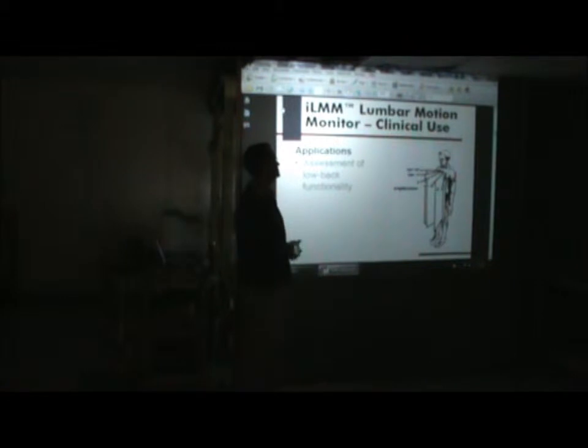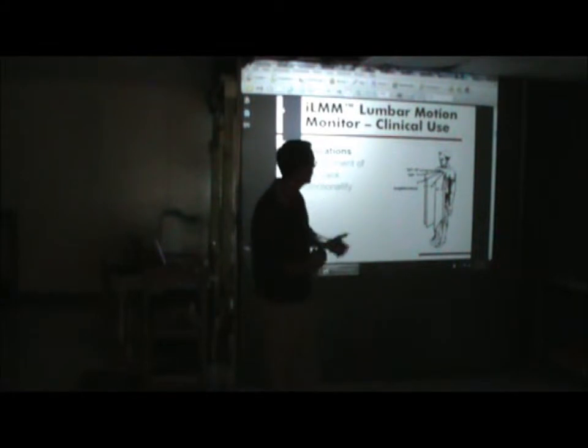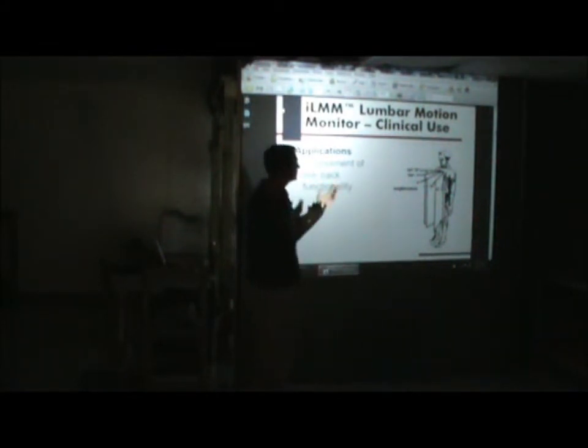Okay. You could use this even for clinical use, if you're trying to see differences in range of motion between users, or ranges of motion before an intervention and after an intervention, to see if they're improving. Since it's giving you kinematic movements of the spine, you could use it for clinical use too. Just wanted to throw that out there. Does that make sense?